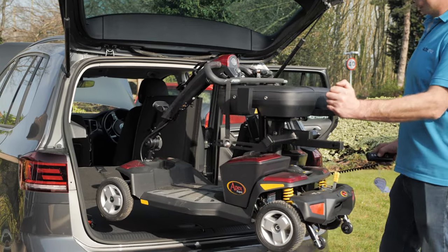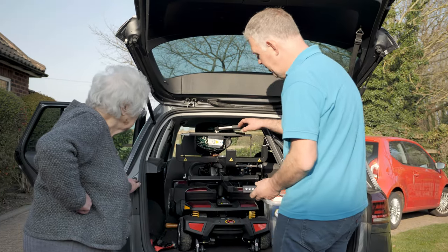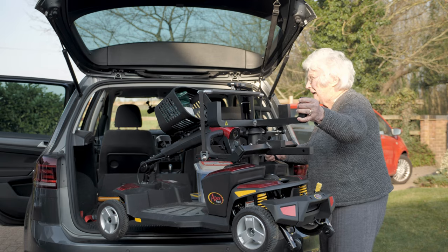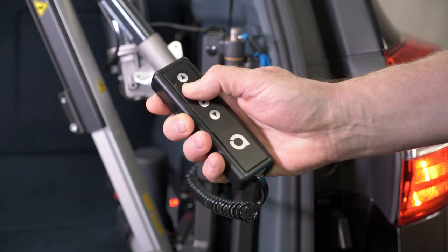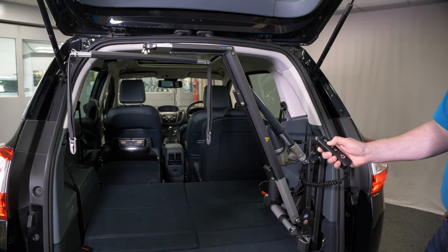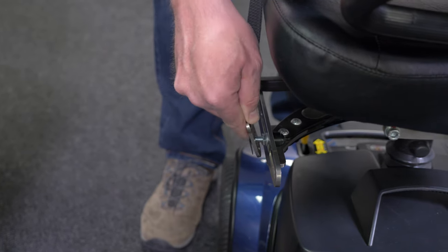Car boot hoist will lift your scooter, wheelchair or power chair and load it into the boot of your car all at the touch of a button. It's the perfect vehicle adaptation for those with reduced mobility. Our boot hoists save you from struggling with weighty components or having to rely on others to lift heavy mobility devices into your car.